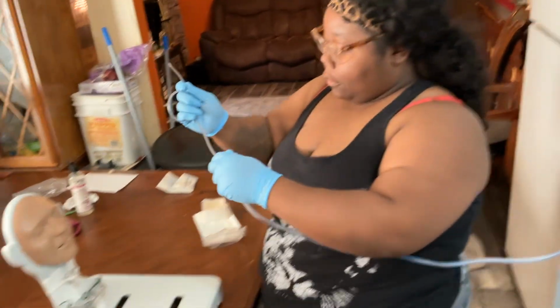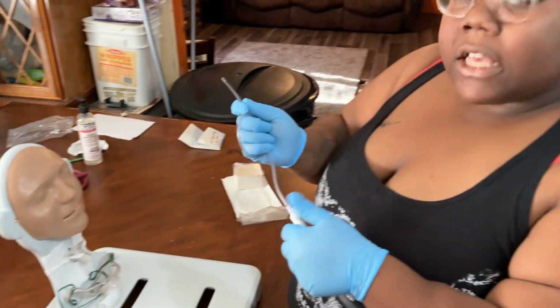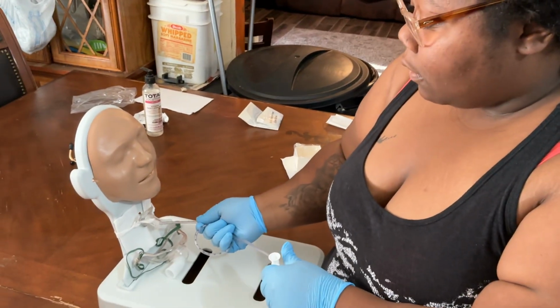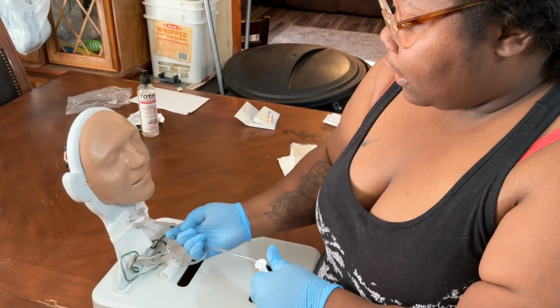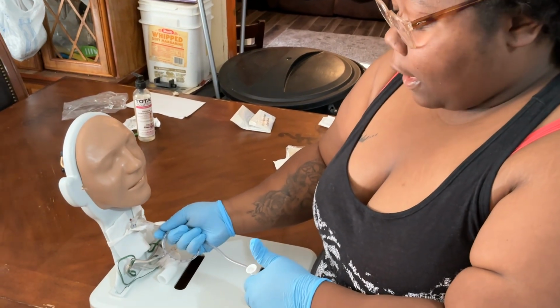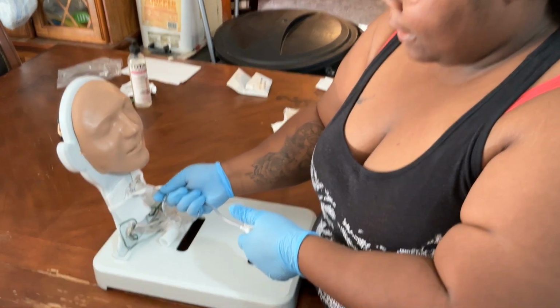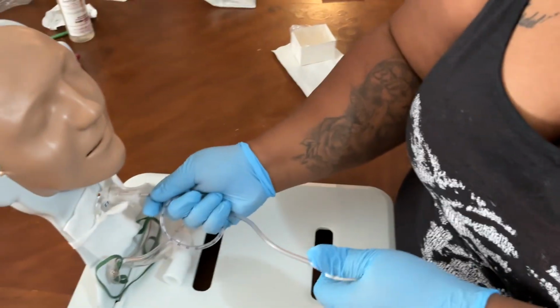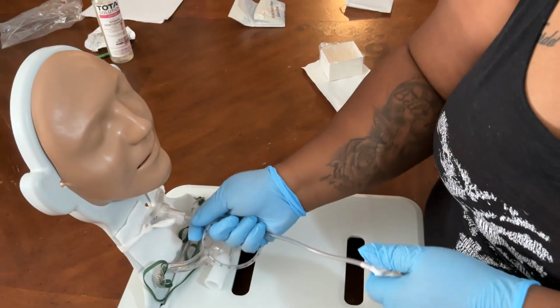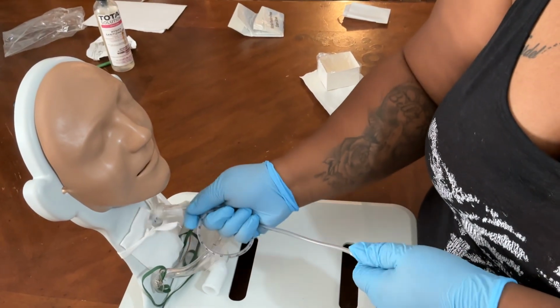So, okay, Jaleisha, what I'm going to do now is go in and suction you, okay? I'm not going to hold that because that is me suctioning, but I am going to go in without holding it, without suctioning. I don't want suction going in. I'm going to go in until I feel resistance, okay? And once I'm in, I'm going to intermittently suction. So I'm going to go around, and I will only do this for 10 to 15 seconds.